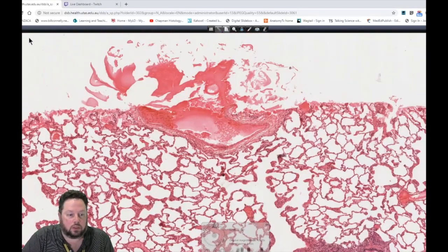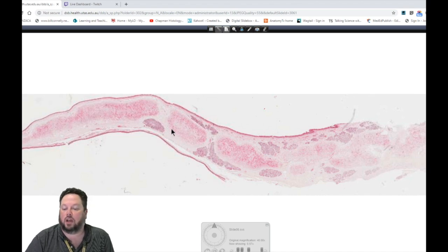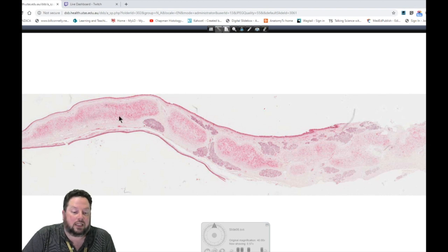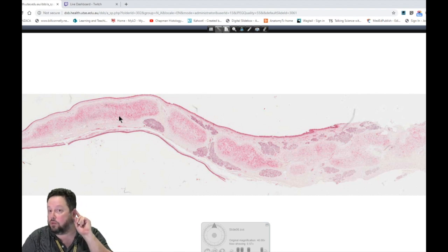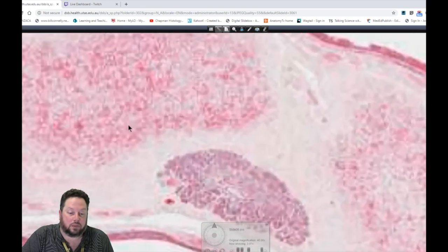All right. Okay, so that was hyaline cartilage. The next type of cartilage we're going to be having a look at is elastic cartilage. Elastic cartilage, like its name suggests, is a very flexible type of cartilage. The classic region where we find it is our external ear, and it gives it its ability to deform and then reform, spring back into shape. And that's because of the abundance of its protein within its matrix, and that is, of course, the elastic fibers.